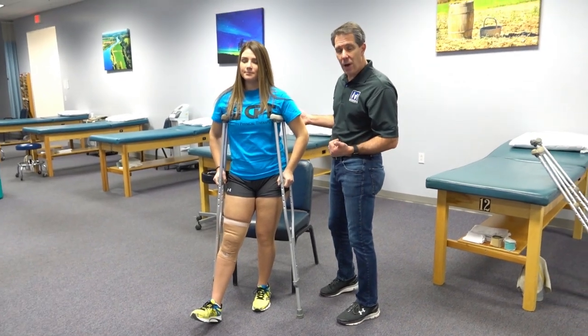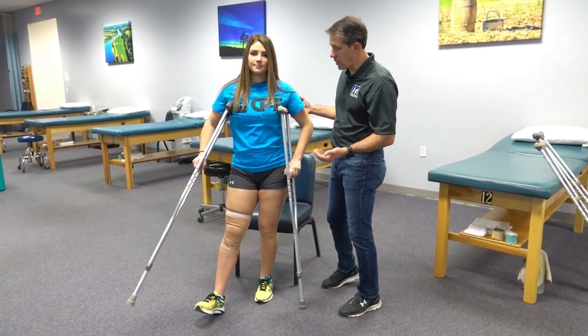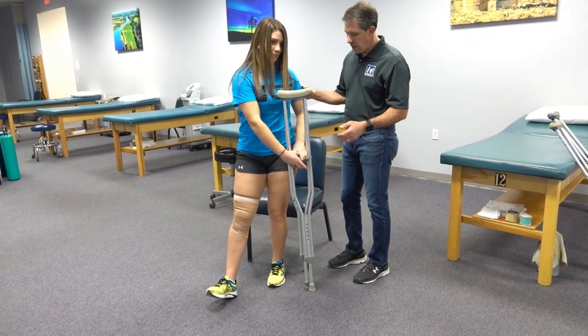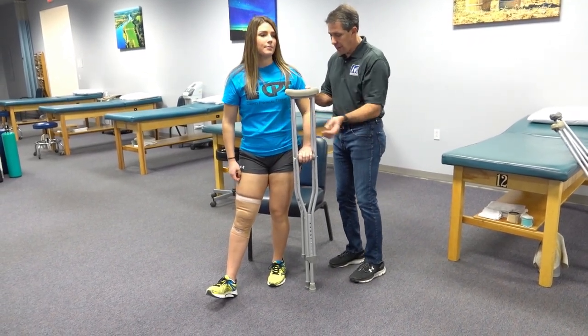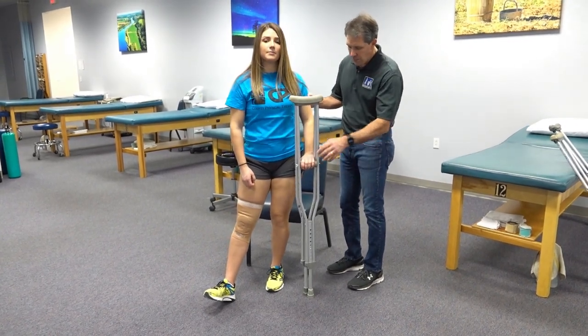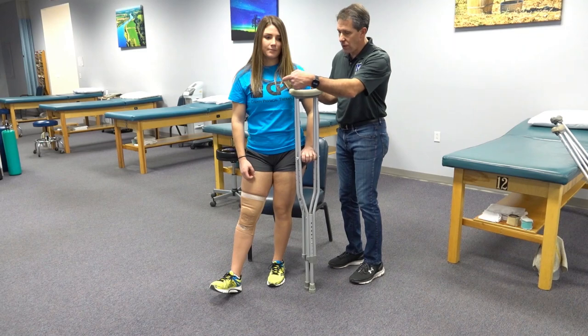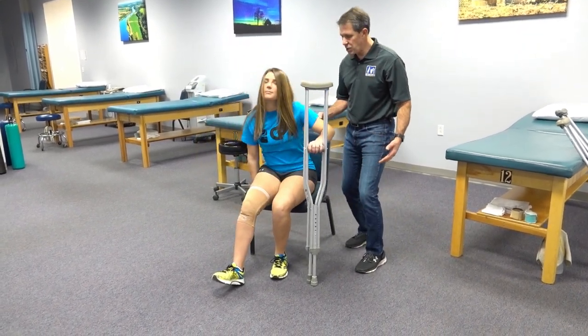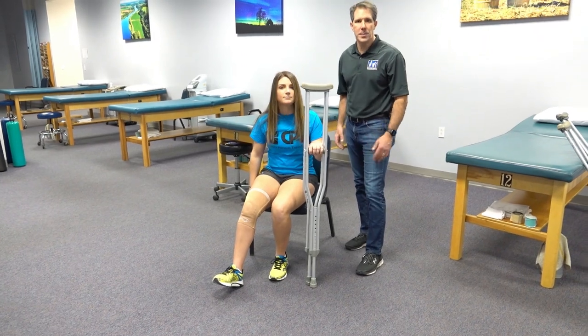Now when you go to sit back down, you do the same thing but in reverse. Bring the crutch over to this side, make sure that you're backed up to the chair so that the chair is really close to the back of your leg. Put one hand on both handles, make sure that you reach back with the other hand, start to bend down, reach for the chair, and then you're in your proper position.